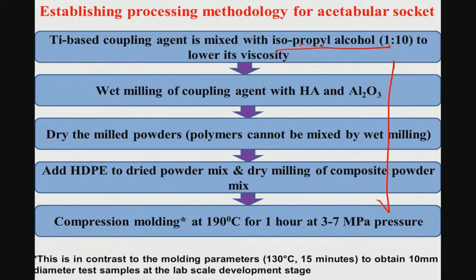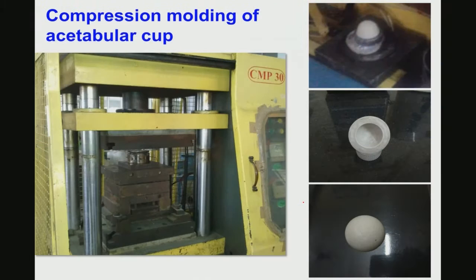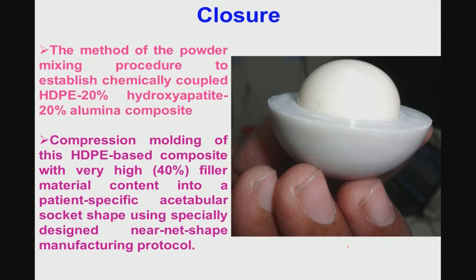After that you can do the compression molding of this large acetabular socket type of device at 190 degrees Celsius for 1 hour at a fairly moderate pressure of 3 to 7 megapascal. This is how the compression molded socket looks, and this is the as-fabricated near net shape. You do not need to do any machining to get the final shape, and this is an illustration of near net shape fabrication of the acetabular socket.